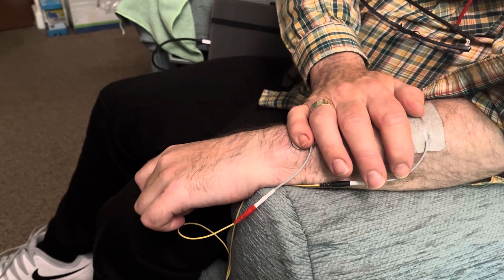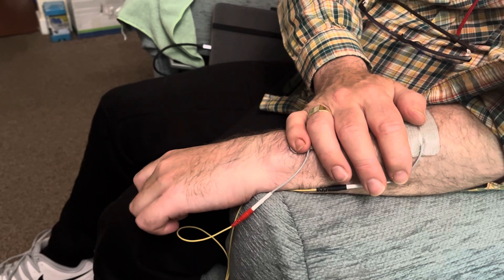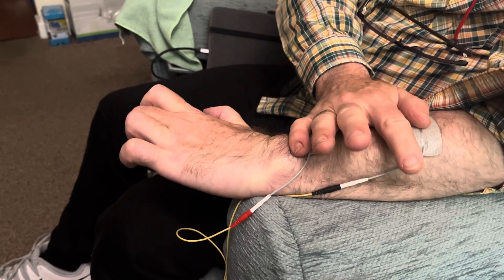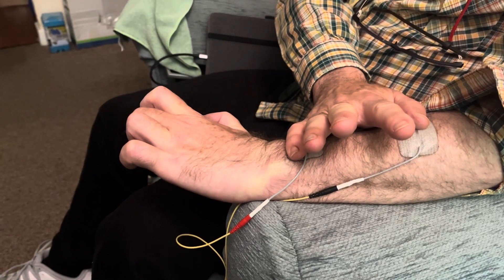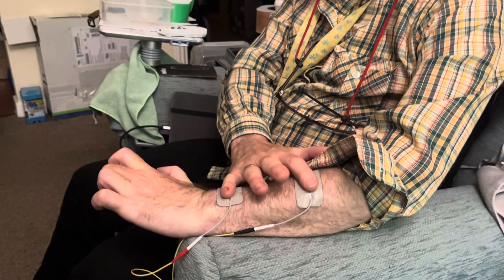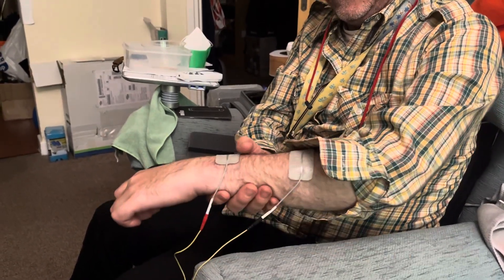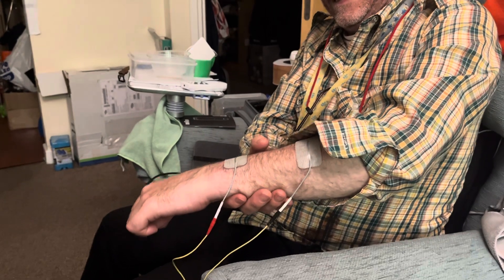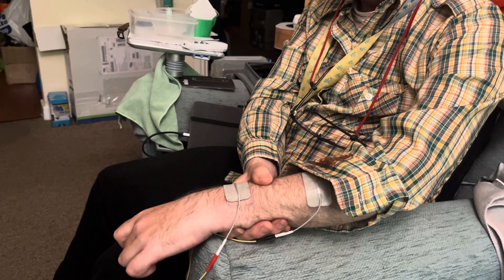We're in the down phase at the moment. In a few seconds it will turn into up phase — there we go. I can feel all the electric shots going all the way up my arm. It feels very, very strange. That's just mad. It's very, very hard — I'll do it again.